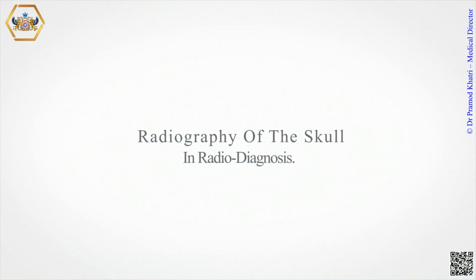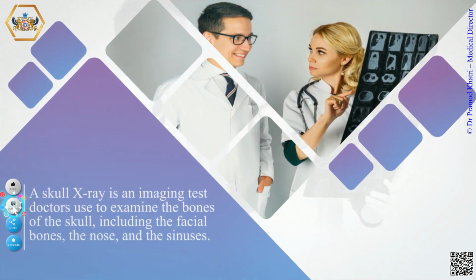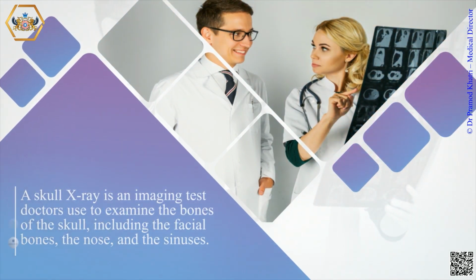Today we will explore radiography of the skull and radio diagnosis. A skull X-ray is an imaging test doctors use to examine the bones of the skull, including the facial bones, the nose, and the sinuses.